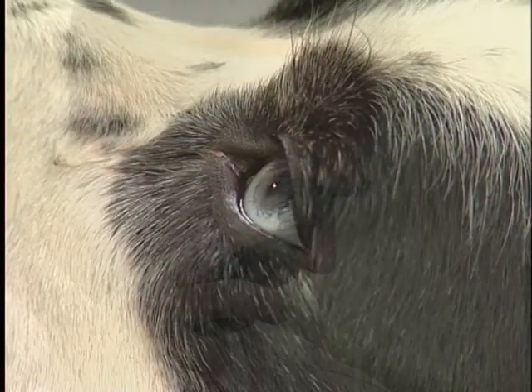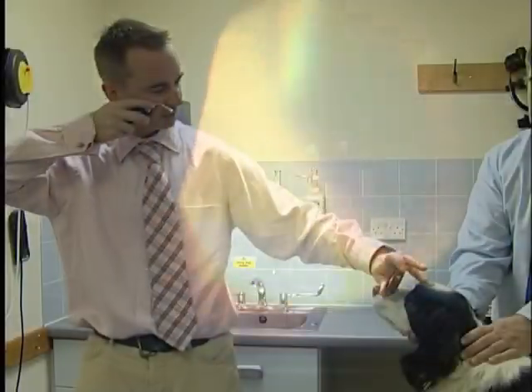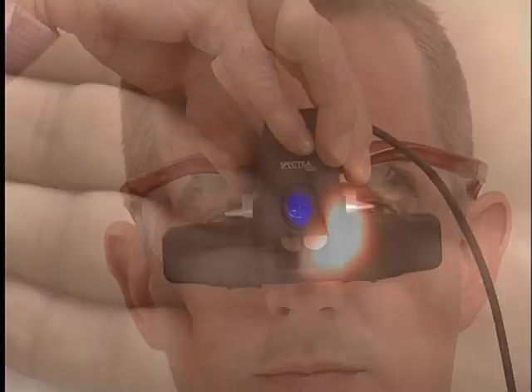The aim of this video today is to demonstrate the correct techniques for retinal examination of a small animal patient and to demonstrate what instruments are available for retinal examination.